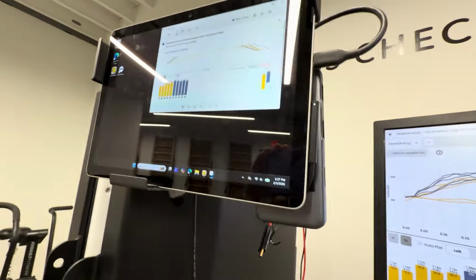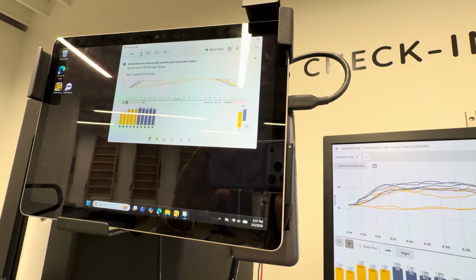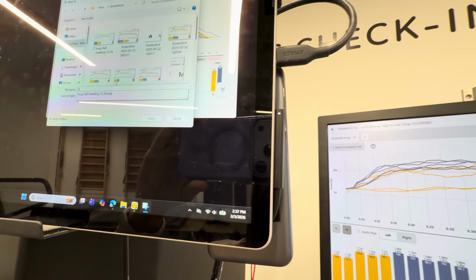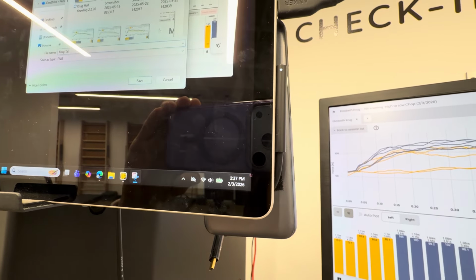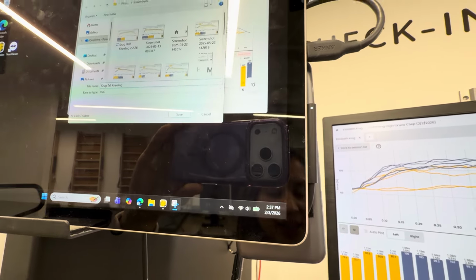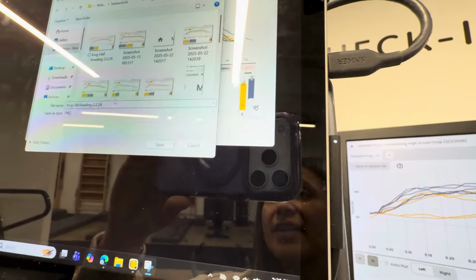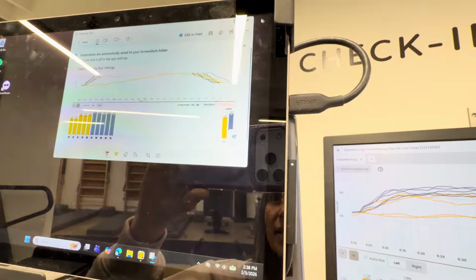And it comes back over here, and now I can save it. So if I click this little save button up here in the corner, it will pop up, usually to right where I have other things saved. And I'll always save with their last name first. So Krug, and then the name of the exercise. So tall kneeling. And I like to insert the date just so I have that also. So 2.2.26 for that test, and I click save. So that's how we save those tests.